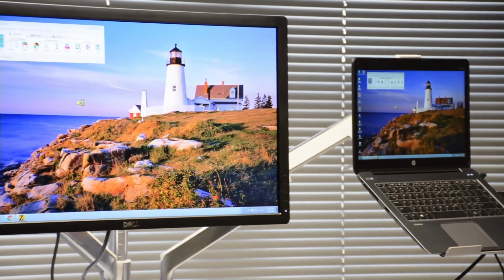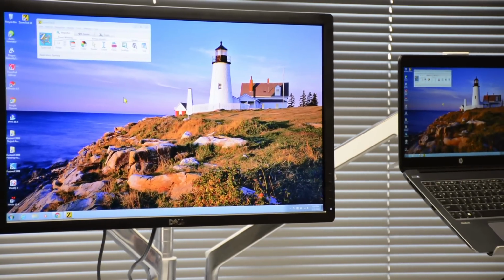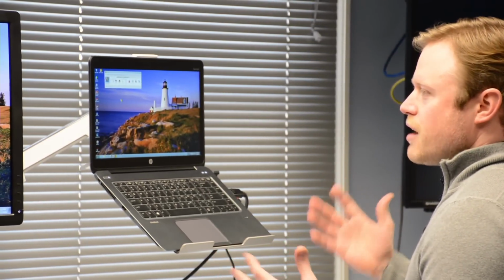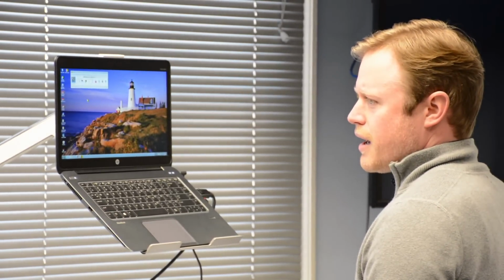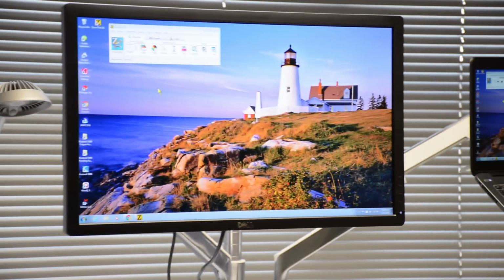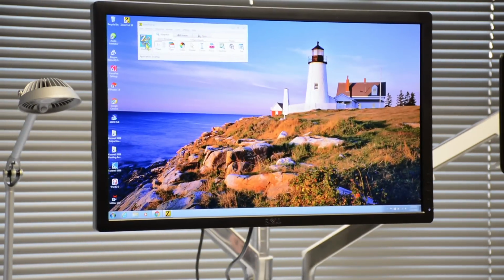The one I'll look at first is ZoomText, and we'll also look at Magic. They're almost identical in terms of their function and their features. But ZoomText is basically a digital magnification software for your computer. You typically would want also to have a larger monitor like we have here. This is a 27-inch screen monitor, so it allows you to really take advantage of magnified text when you're using software like this.